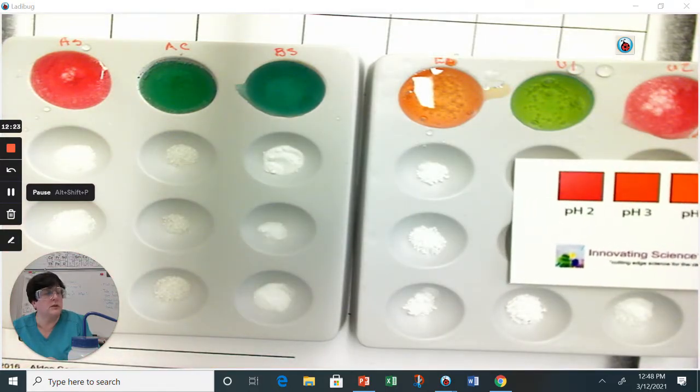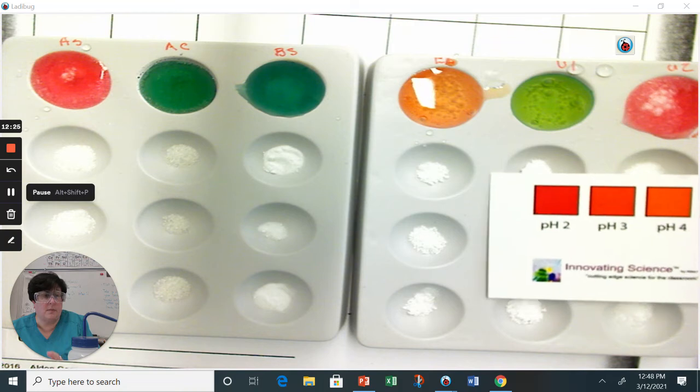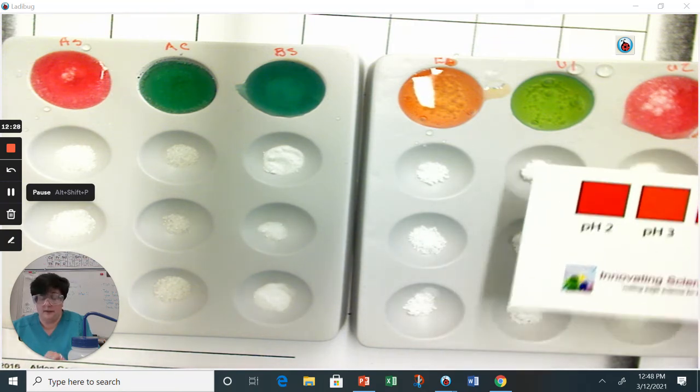Okay, record your color, record your pH, both. I want to see them both. All right.